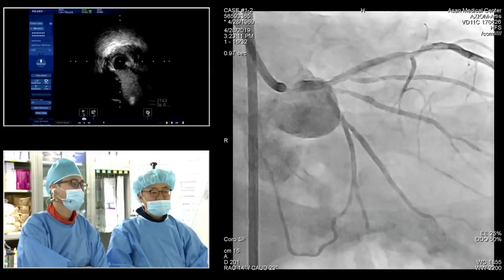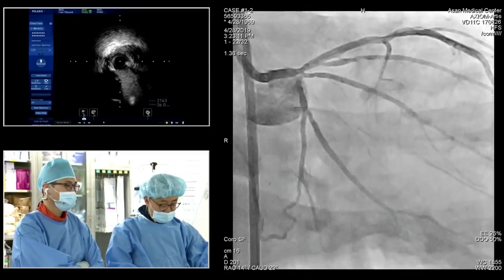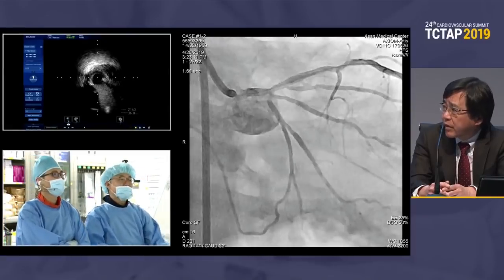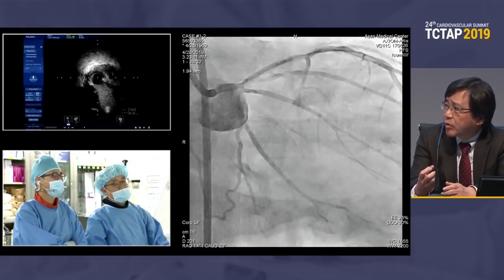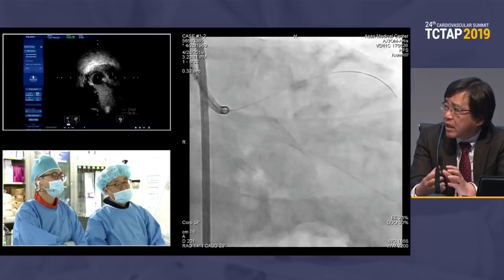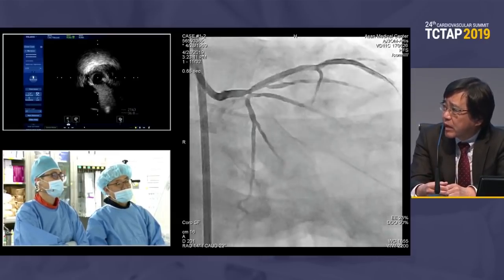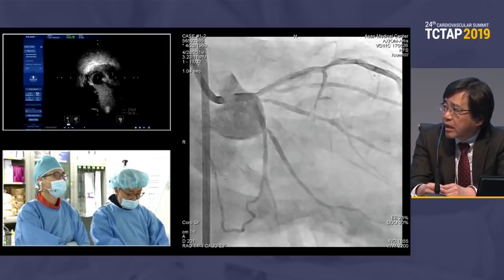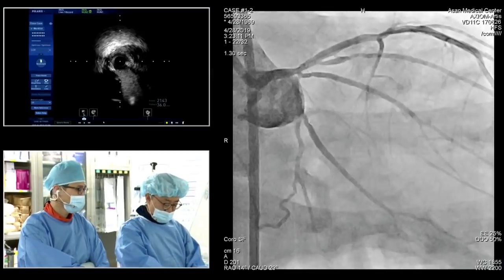Dr. Takeshi? Basically, I would agree with Antonio. I would try provisional stenting, first pre-dilating the left circumflex. The ostium of the circumflex has moderate to severe calcification, so I could not expect a very good result. But if it is acceptable, I would proceed to stenting of the left main to LAD and look at the result. I prefer a single stent too.